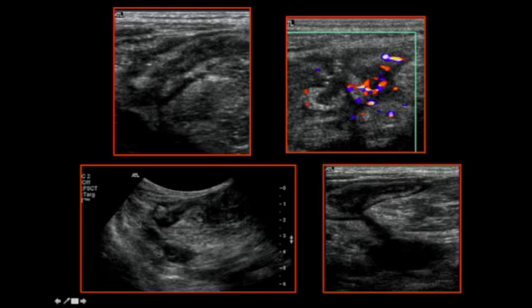You will not see these fistulas unless you look for them specifically. They can be quite easy to overlook, and in addition, they often require opening up the field of view with the curvilinear probe because they can be quite deep structures and they can be missed if you stick to scanning with only the linear probe.